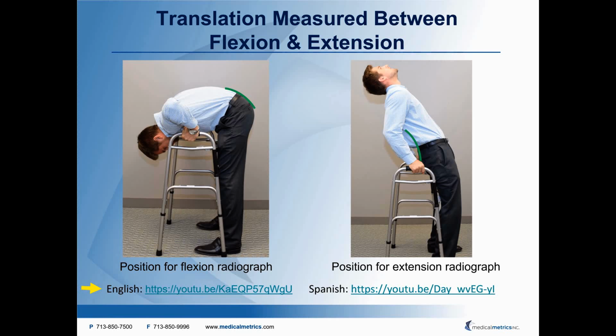This protocol was used in one of the studies where we collected lumbar flexion extension studies on several hundred asymptomatic volunteers. All volunteers watched the video before they went for the exam. Over 95% of the flexion extension studies had at least 5 degrees of rotation at every level from L1-L2 to L5-S1.